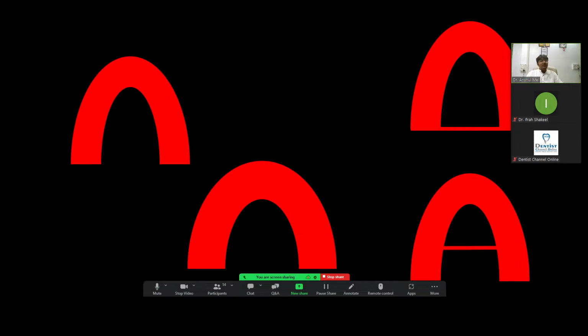So that's why you have to use a non-hex abutment to create the jig when you have full arch cases and you are working at the implant level. If you are working at the abutment level, then you have a different kind of jig that you can use for that particular case.